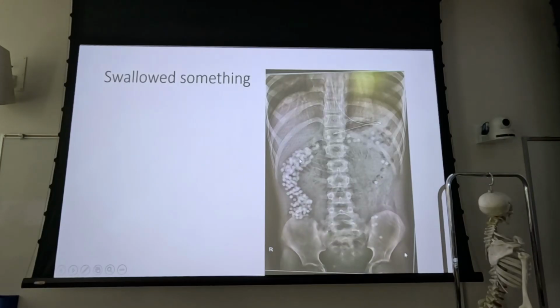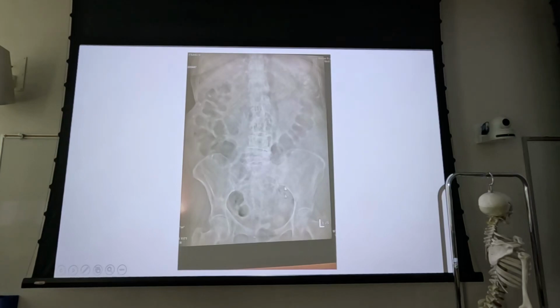And what are Orbeez? They explained it to me, but I don't remember. Little plastic balls that grow in size if you fill them with water, and they're squishy. Okay. When I first saw this, I was like, was it desiccant? Which do kind of the same thing, they absorb moisture. Orbeez, okay. Again, more osteoporosis, a little bit of rotation.